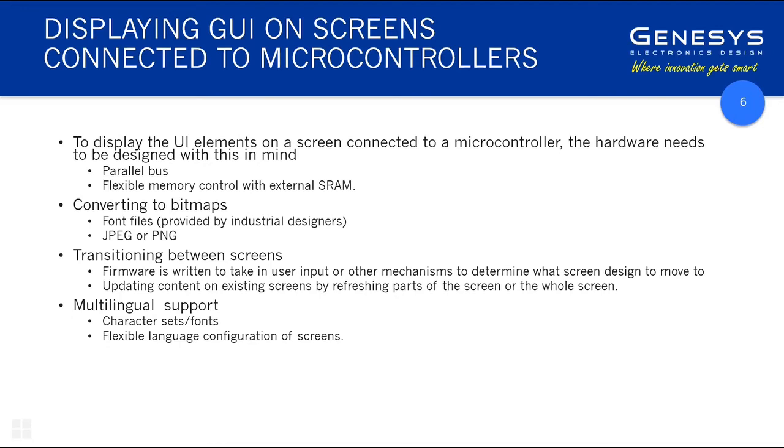It also allows for things like multilingual support, of course, such as character sets and fonts, and flexible language configuration of screens. If you have an LCD display and a medical device that is being launched all over the world, the ability to transition between different languages is a key element of that.